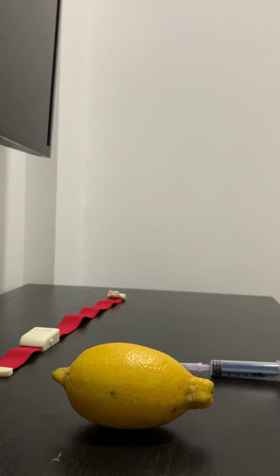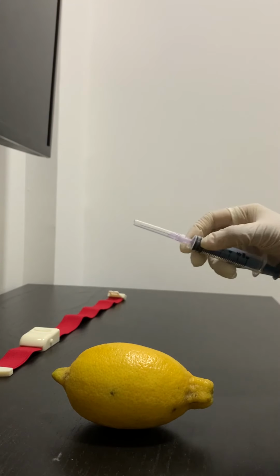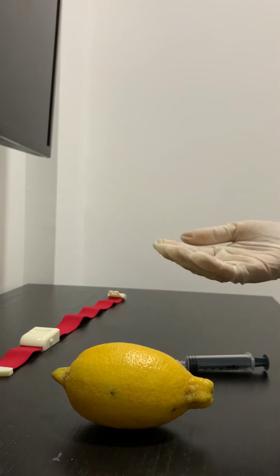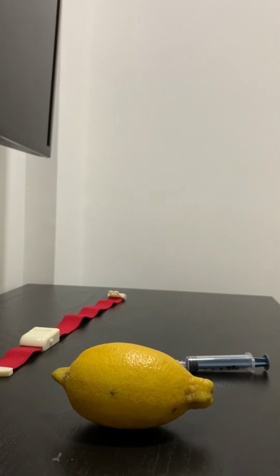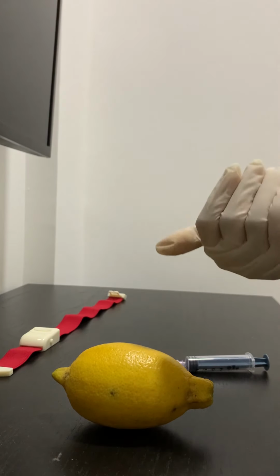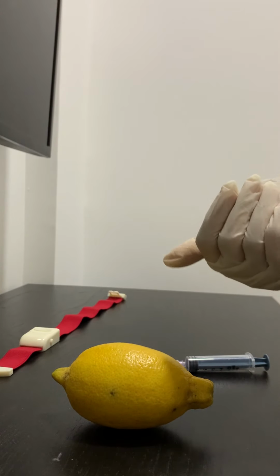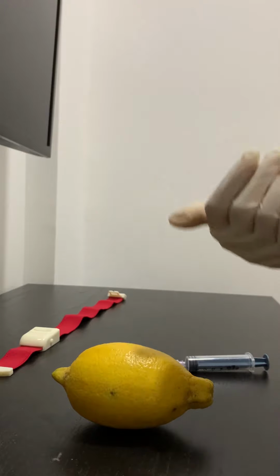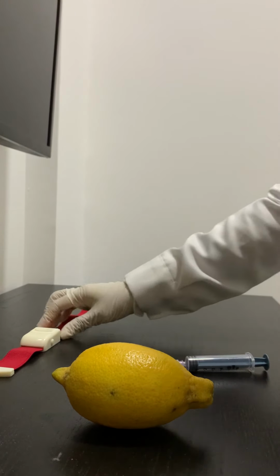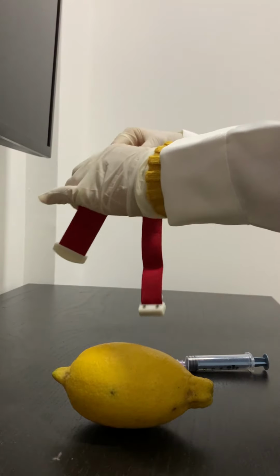These materials are the syringe, the needle, the medication for the injection, sterile cotton, sterile gloves, and apron for the staff to wear. And if you are giving IV, you will need the tourniquet. This is a buckle tourniquet.